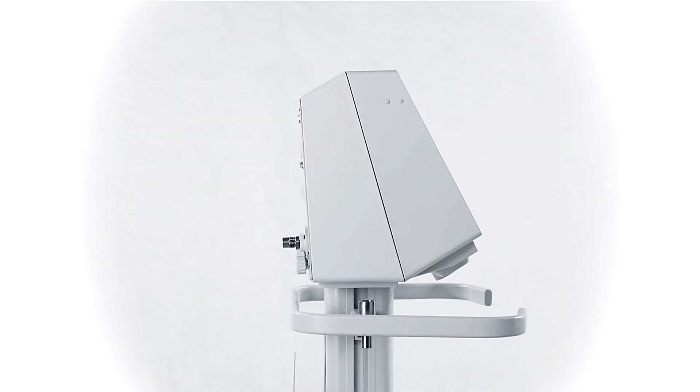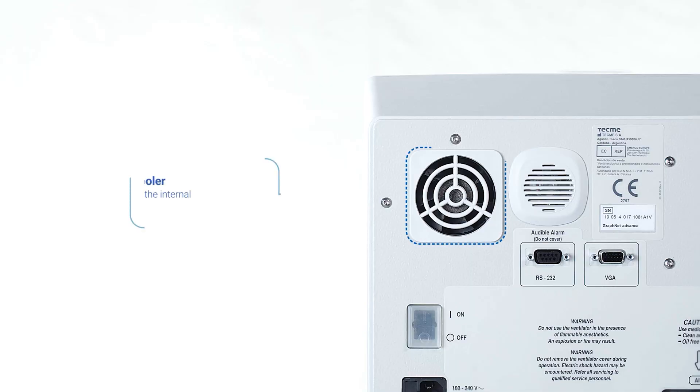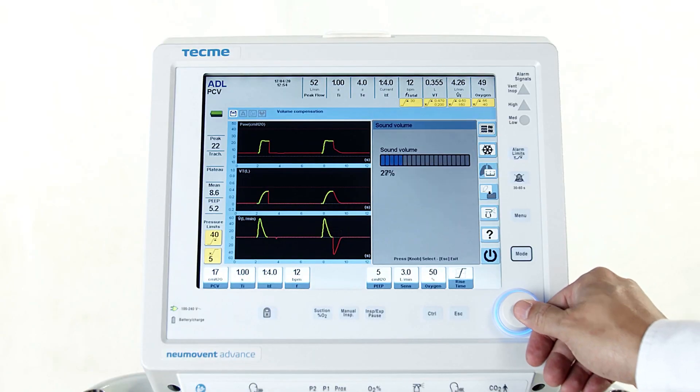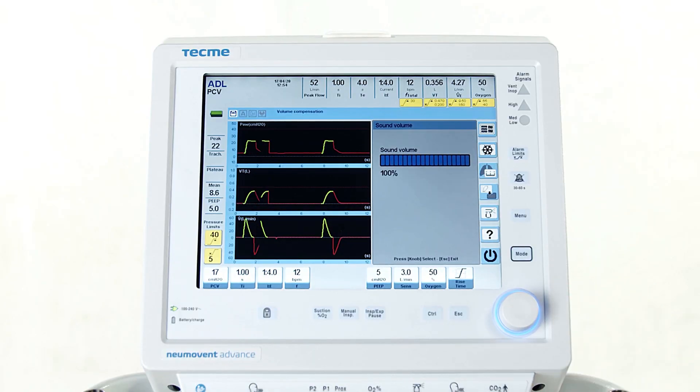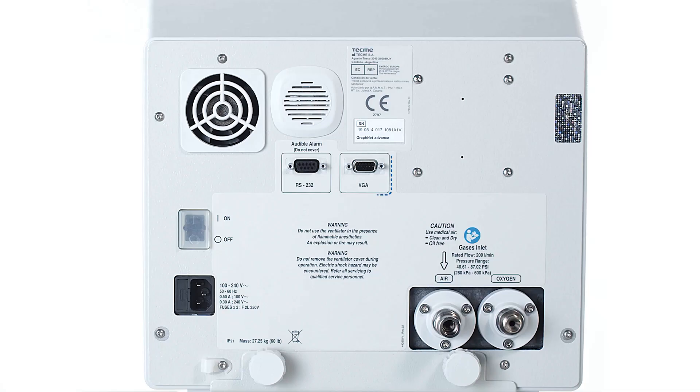The rear panel includes the following items: a cooler, which refrigerates the internal electrical components of the ventilator, and a speaker, which emits sound signals if an alarm is activated to warn the user about an issue related to the device or the patient. The alarm volume can be set from the user menu. The speaker should never be manipulated.